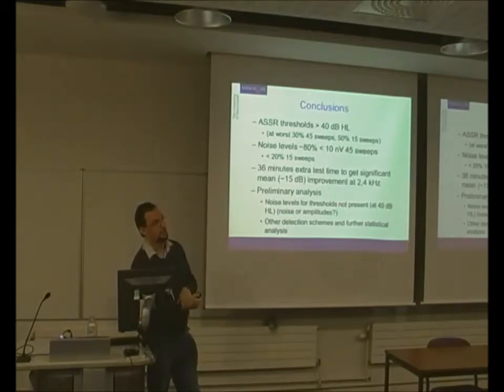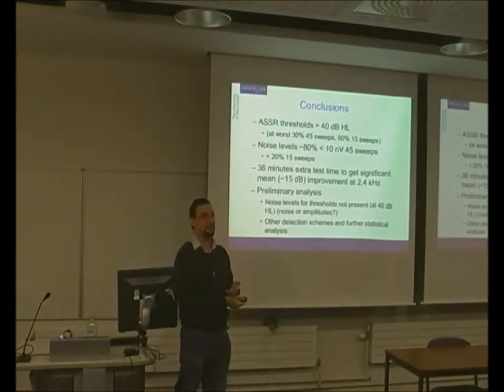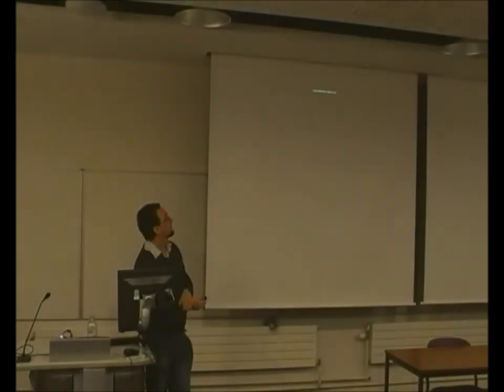It could also be that, as we know, response amplitudes are quite variable between and within subjects between sessions. I found that in previous literature, so that's something to look at as well. We can also analyse the repeatability of amplitudes and noise across all these recordings. So there's a lot more to do with this data yet. And that's about what I have to say today. Are there any questions?